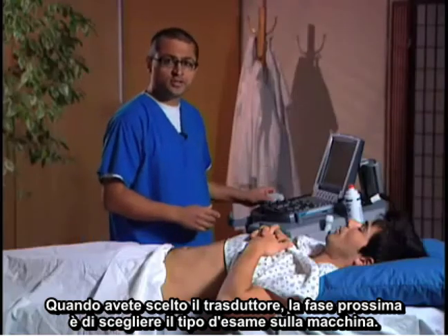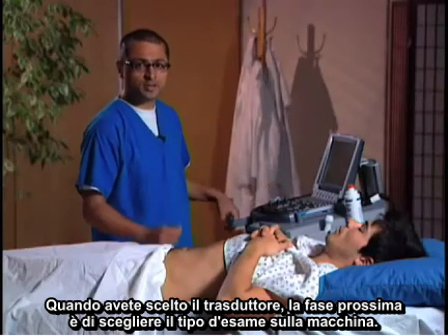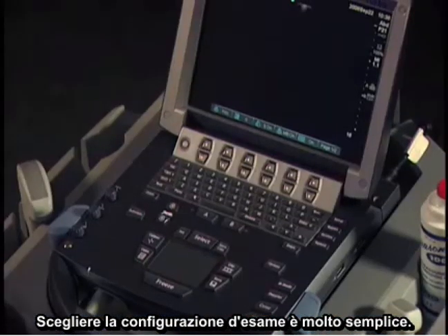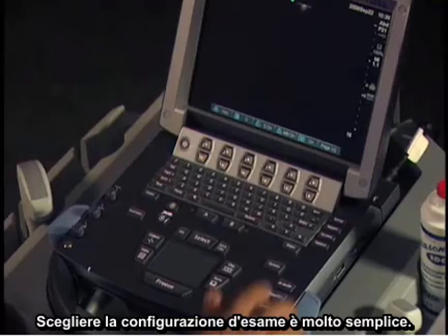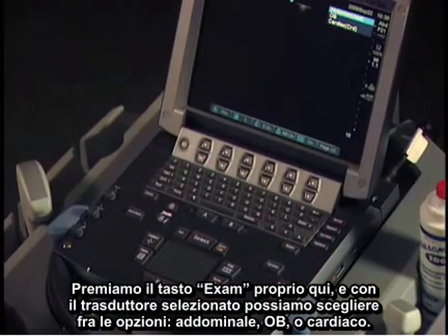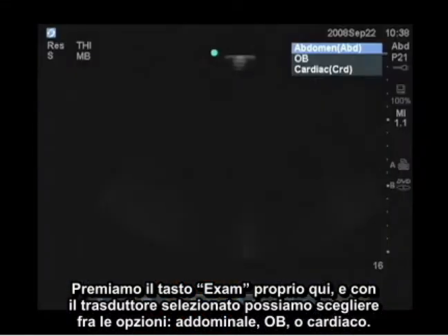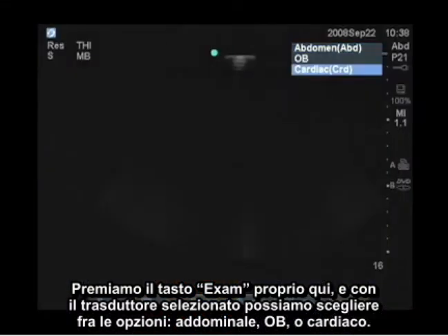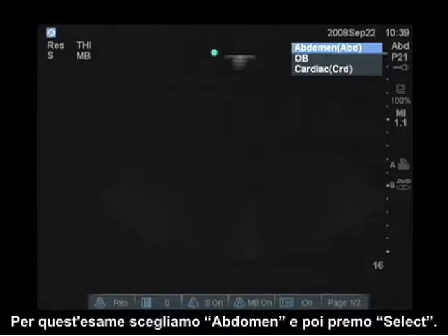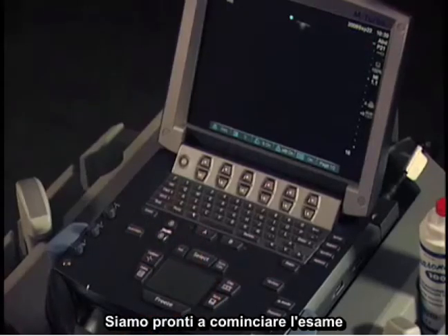Once you've chosen the transducer, the next step is to choose the exam type on the machine. To choose the examination configuration, we hit the exam key right here. With the selected transducer, we can choose between abdominal, OB, or cardiac. For this exam we're going to choose abdominal, so I'll hit select and we'll be ready to start scanning.